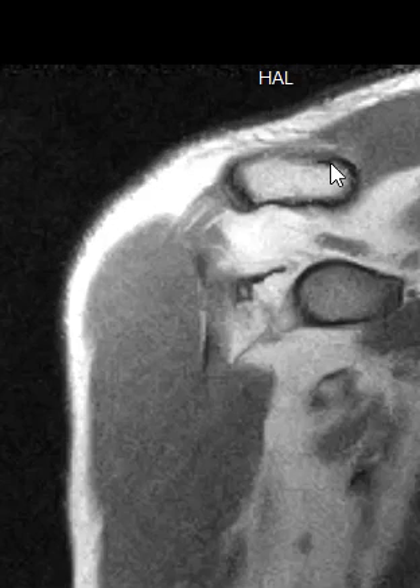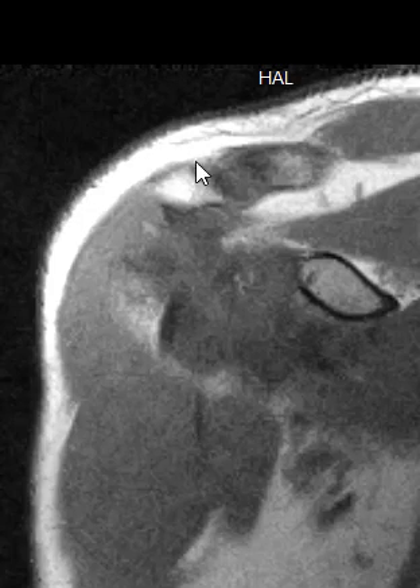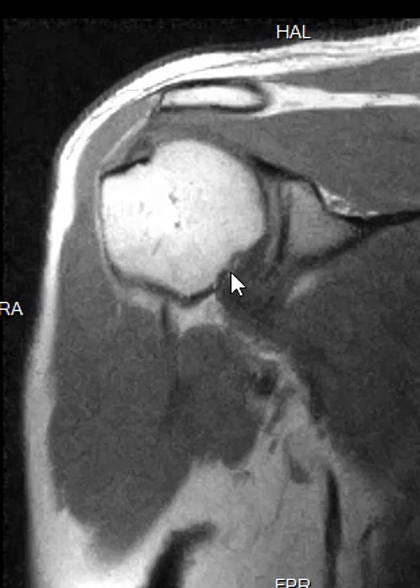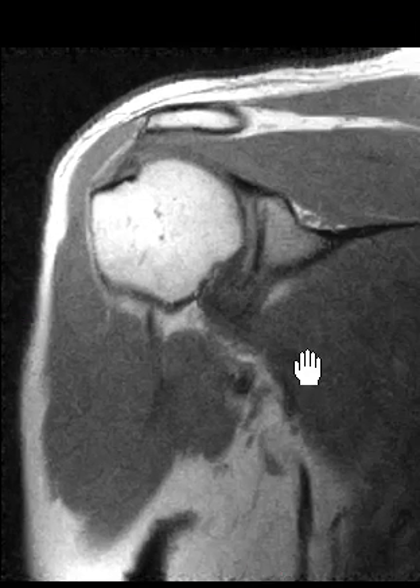Above the shoulder joint we see something called the AC joint — that's your acromioclavicular joint. Here's the clavicle and acromion where they come together at the AC joint, and luckily your AC joint looks great, no arthritis. Beneath the AC joint we have something you've probably heard of called the rotator cuff.